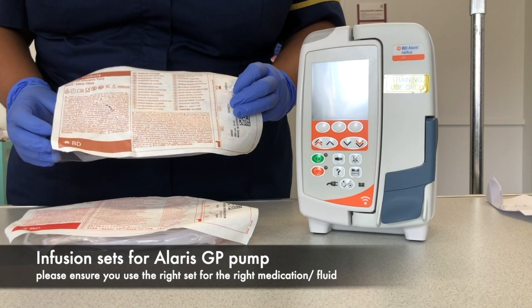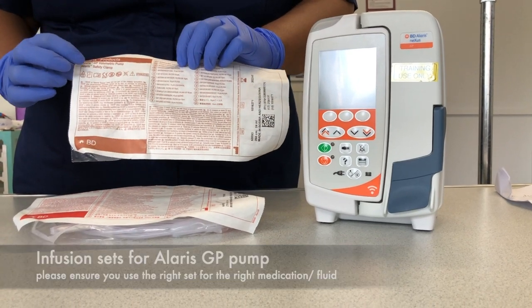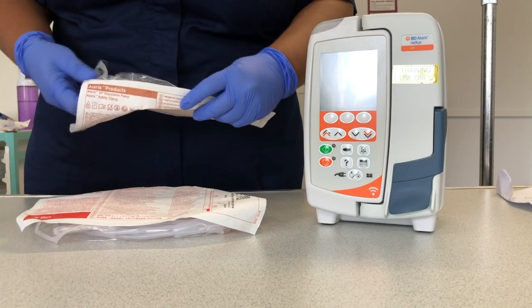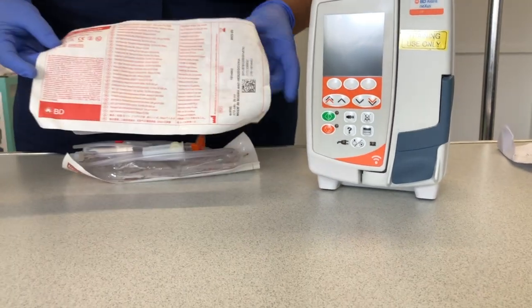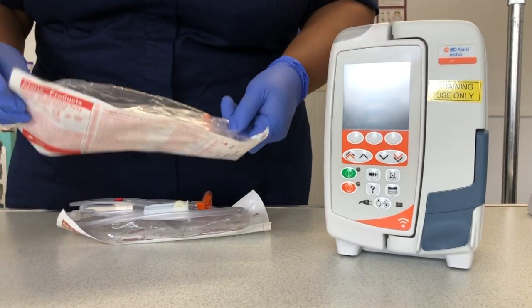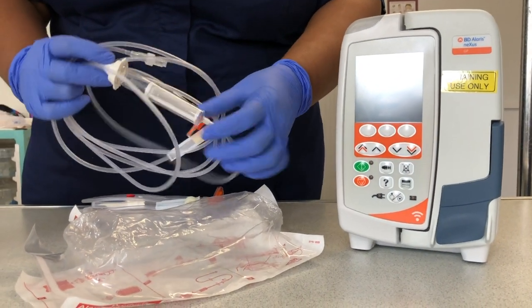There are two giving sets used with the Alaris GP pump, which is the normal standard set when it says Alaris GP Volumetric. And this is the set. And the blood transfusion set, which is red in color. And the difference is it's got a filter in the pump.